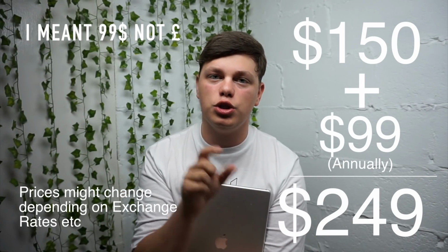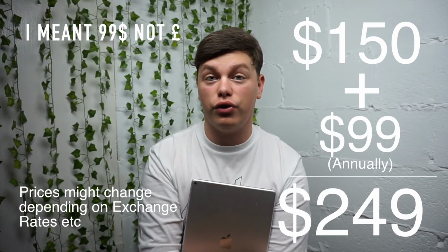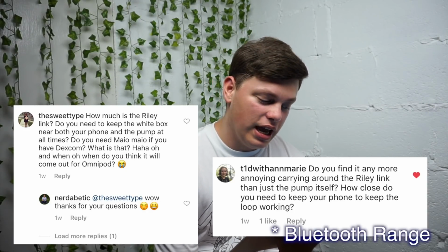And that account allows you to create an app on your phone and allows you to keep that app on your phone for a year. Next question. I've already answered the cost one. Do you need to keep the white box near both your phone and your pump at all times?